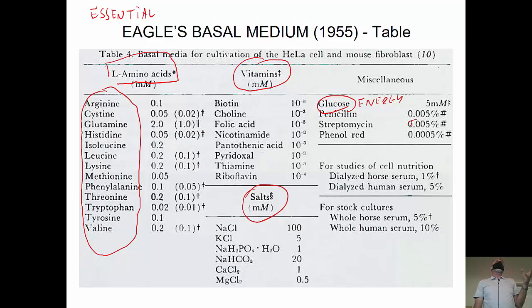So if you get a little bit of bacterial contamination in there, and you look at your plate 2 days from now, it's only going to have bacteria, because they're so fast at growing, they'll just outcompete the mammalian cells. So often there'll be different antibiotics, and this particular one has 2 antibiotics, penicillin and streptomycin. These function in different bacterial pathways, so it targets 2 separate pathways, the cell wall and translation.